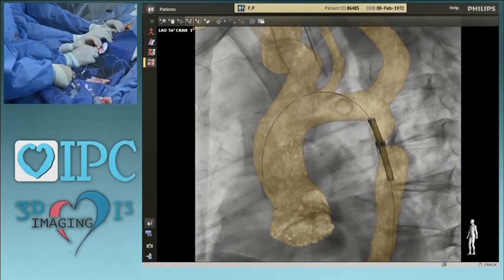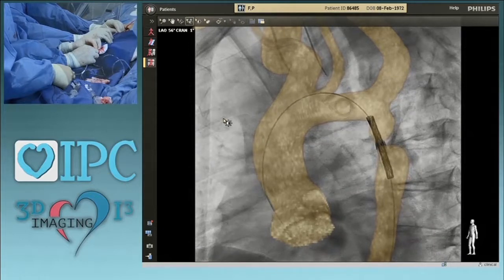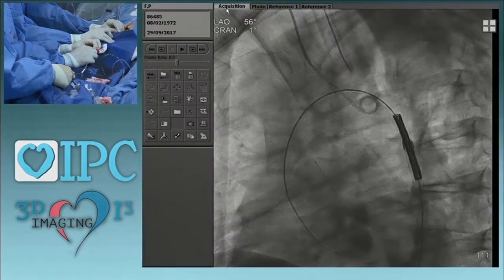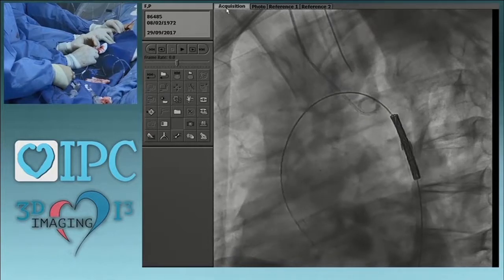Yes. So now we are going to. I think it's okay. The position. Yeah, it's okay. It'll shorten a little, I think, won't it? Yes. Let's see again the picture we have done to show. Yeah, we can. Well, we can uncover. Uncover. Yeah. Inflate the inner balloon.